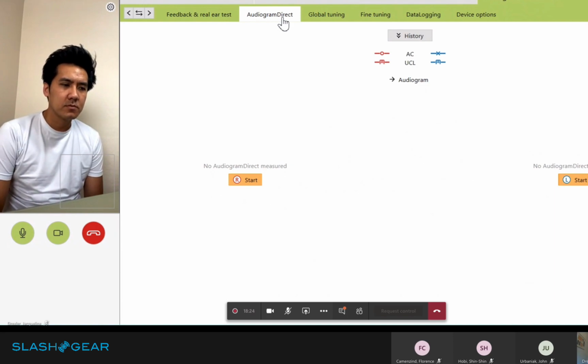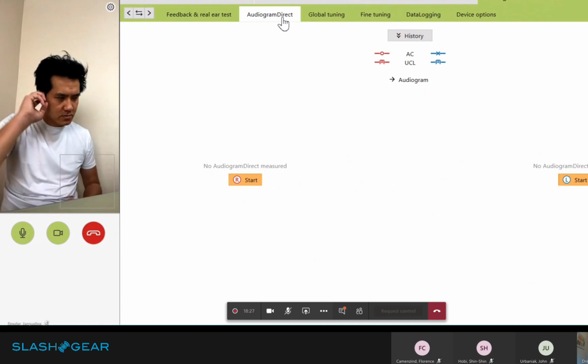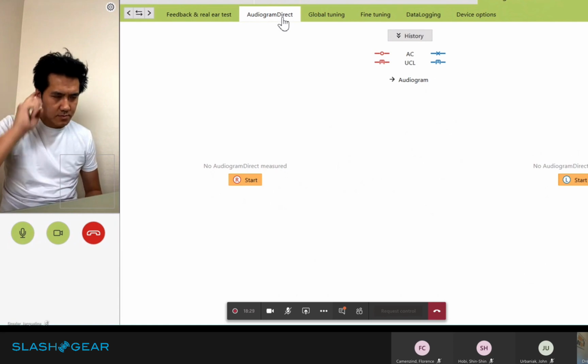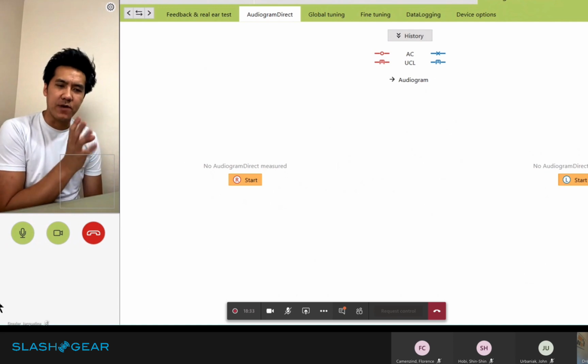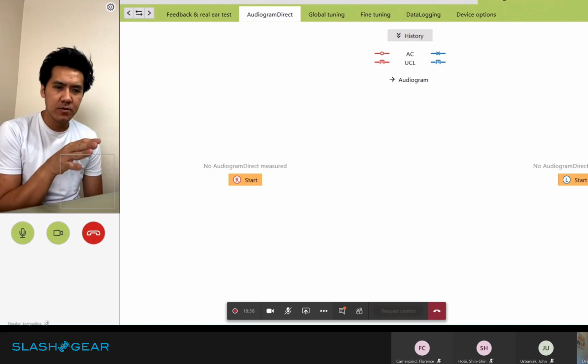So it was taking all that information to just cross-check those thresholds. So it's just personalizing the fitting to the client. Oh, perfect. So it's going to be even more accurate than what the profile I have on there now. Or... So it's a different goal.